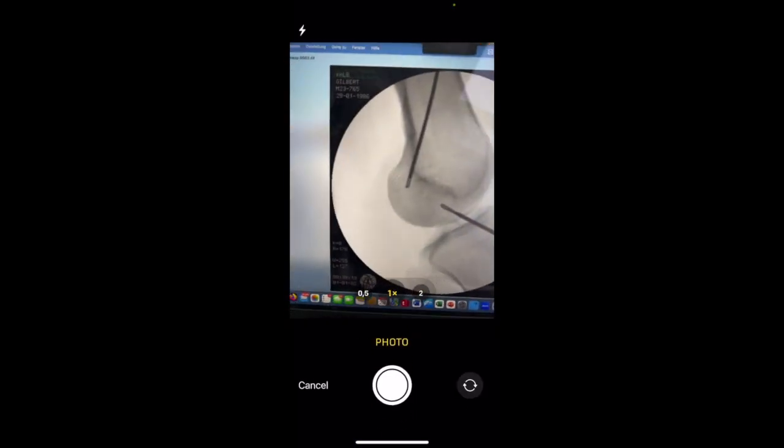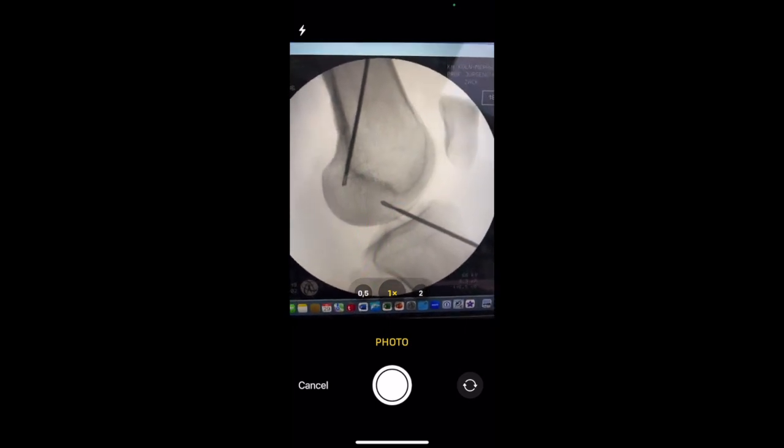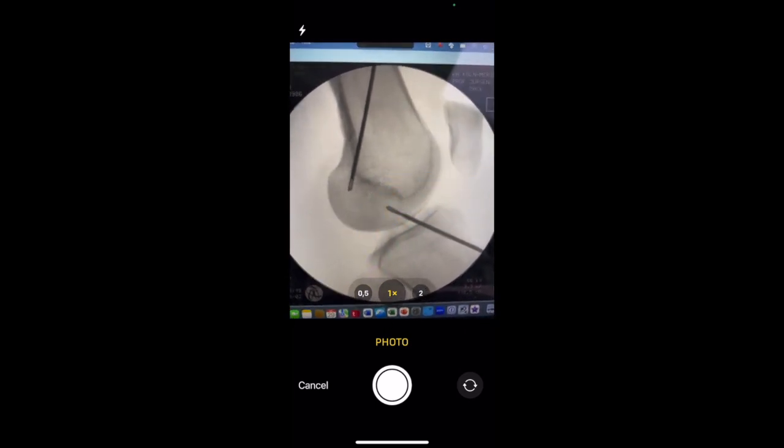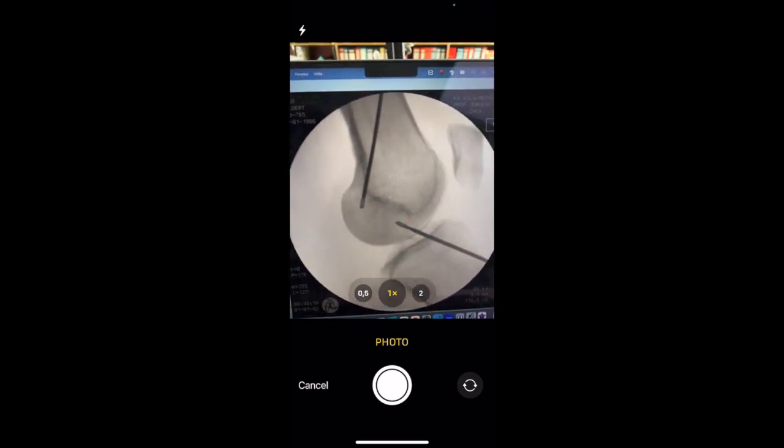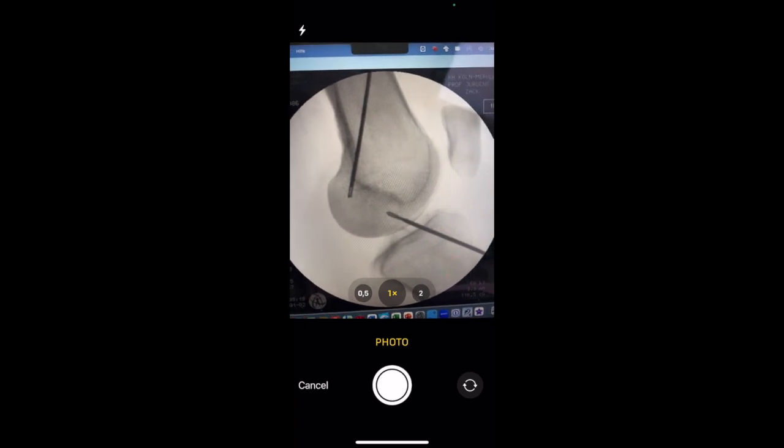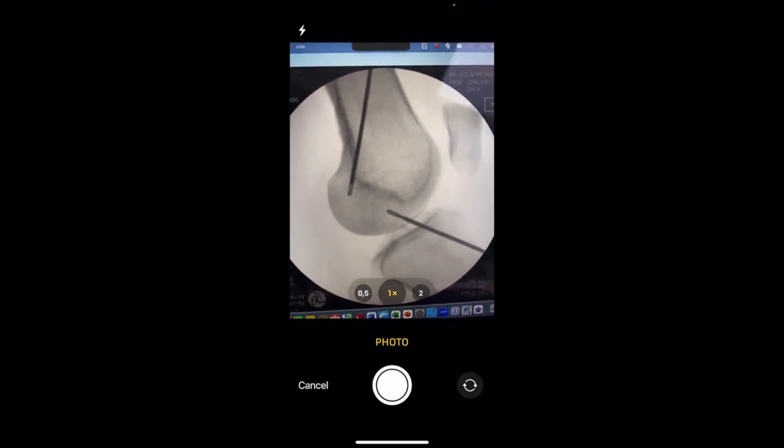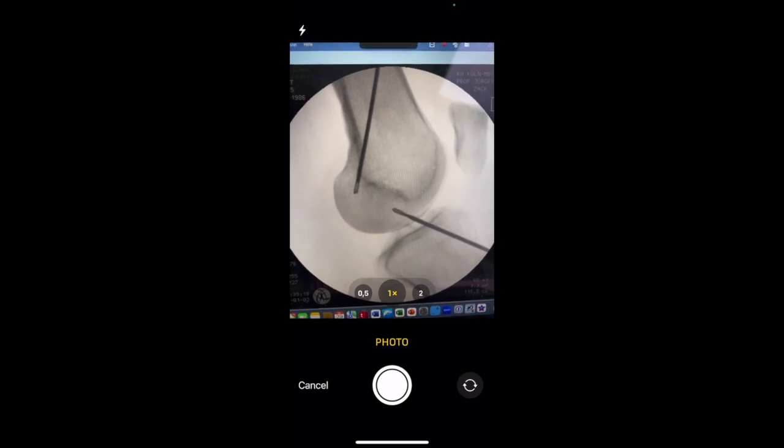In this case I just use my computer screen where I have my fluoroscopic image of a true lateral radiograph, with the tip of the K wire being right at the spot where the center of the femoral insertion might be.